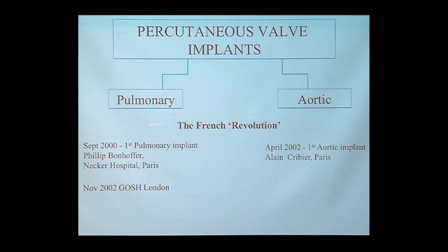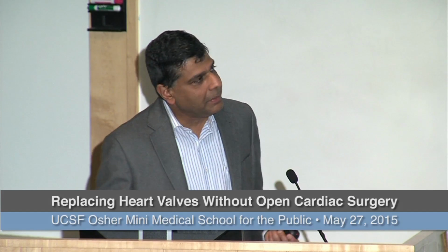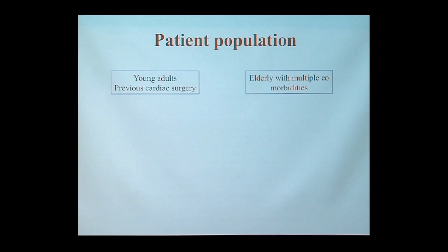So actually, whether we like the French or not, we do owe them a debt of gratitude because it was them who developed this technology. And the first implants in England were done in 2002 in the Great Ormond Street Hospital in children in London. So the patient populations are two different things. For the pulmonic valves, it's young adults who have had previous heart surgery, born with a congenital heart condition as a child, usually having had multiple cardiac surgeries, often more than one.